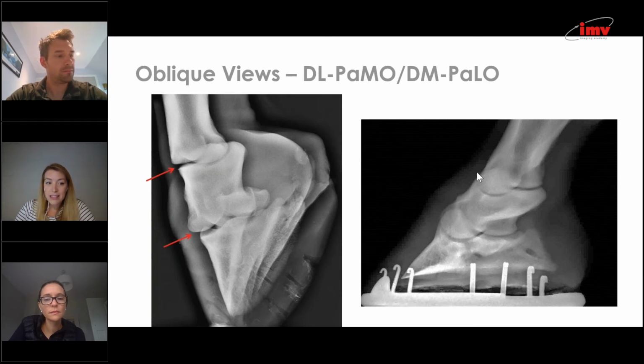The one disadvantage of getting a flexed one is that it's a little bit more tricky. So these flexed ones are required in a clinic, and for foot radiography we would always have 4 people. So there would be one person designated flexing the limb, someone plating, someone holding the horse, someone acquiring the radiograph. You don't often have that luxury. So it kind of depends on who you have helping handler wise and how good they are at multitasking.